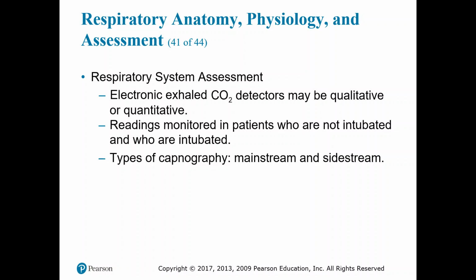The quantitative devices are by far better. They are what we want because we can look at the number and judge our gas exchange and what's going on with our patient with that information. Exhaled CO2 readings are monitored in patients who are intubated and not intubated.